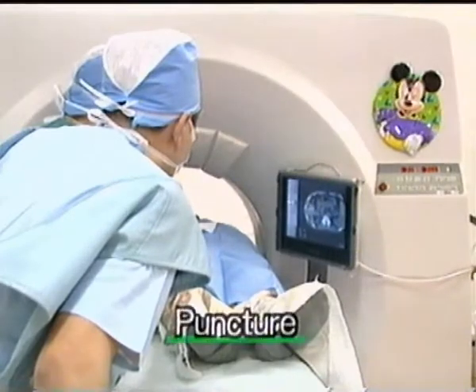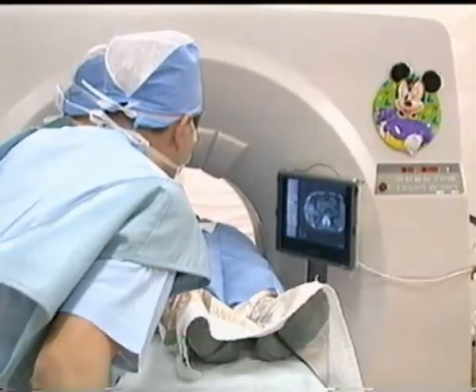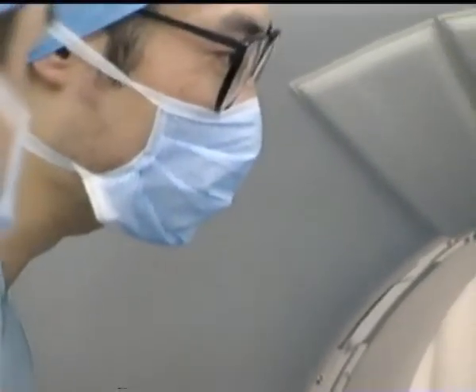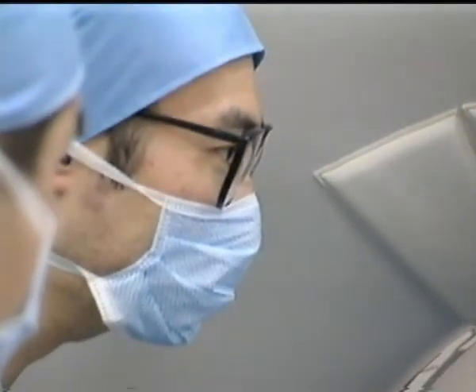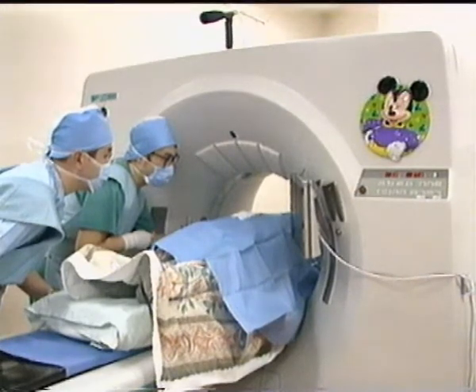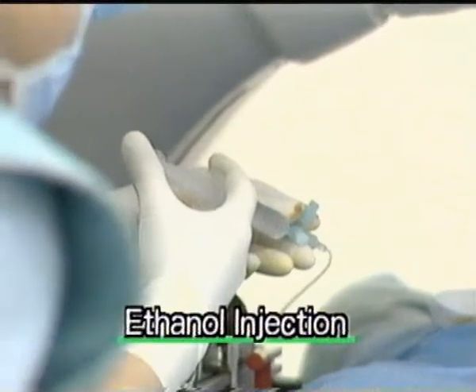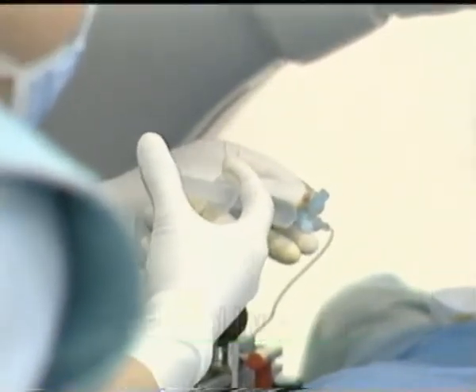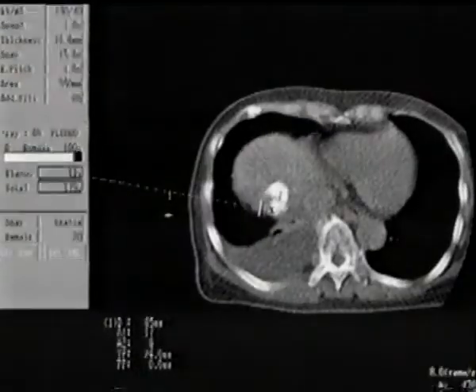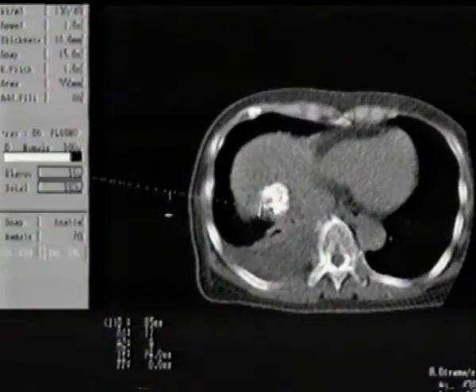The position of the needle tip can be checked in real time, as the puncture image is reconstructed and displayed in just 0.125 seconds. Both the patient's and operator's X-ray exposure is drastically reduced, as the tube current is lowered to a minimum of 10 milliamperes. Using the fluoroscopic image to check that the needle has reached the tumor, anti-cancer drugs are injected continuously. In this case, a mixture of ethanol and contrast medium is injected.